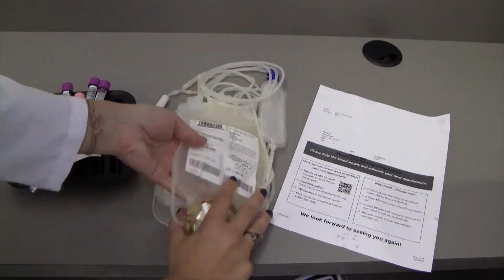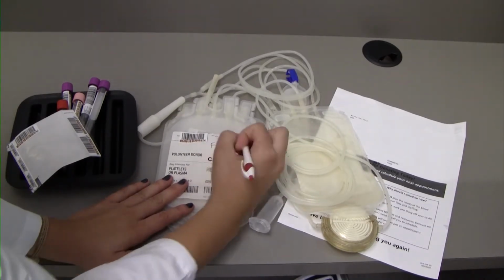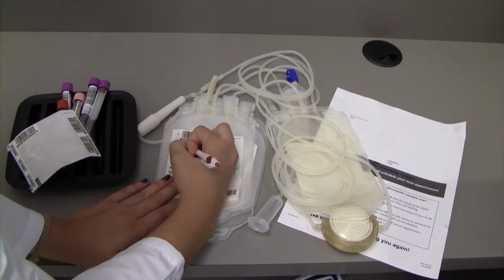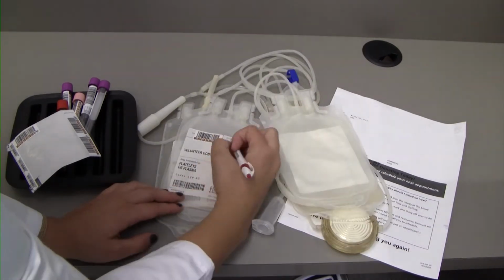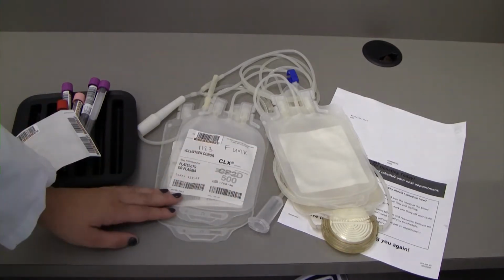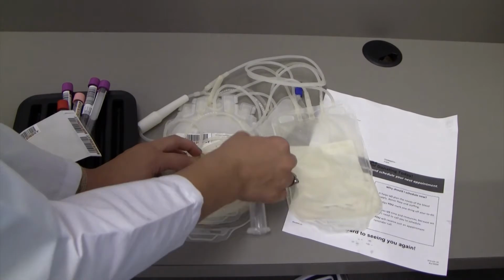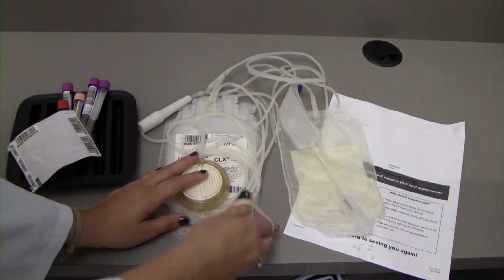Write on satellite bags, blood type in the upper right corner, sex male or female in the upper right corner, prep time in the middle. Secure satellite red cell storage bags and coil with a rubber band.